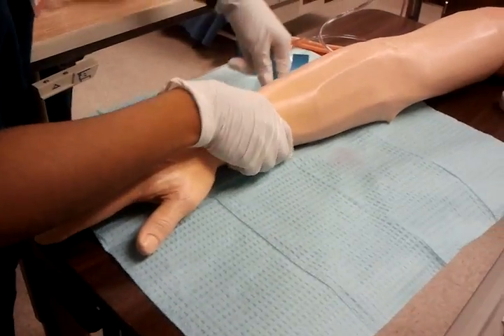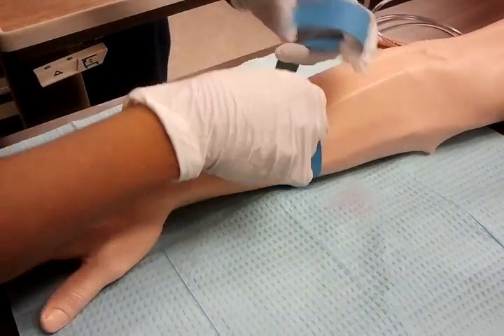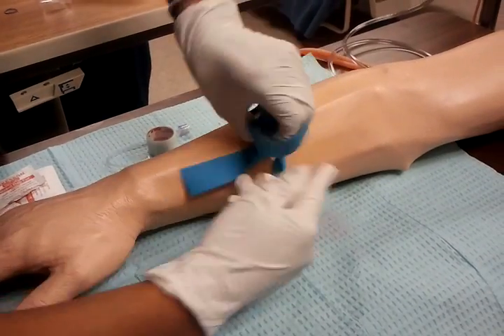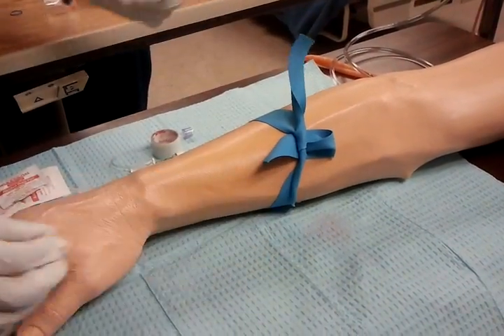Apply the tourniquet 6 to 4 inches above the intended access site. And appropriately select the vein.